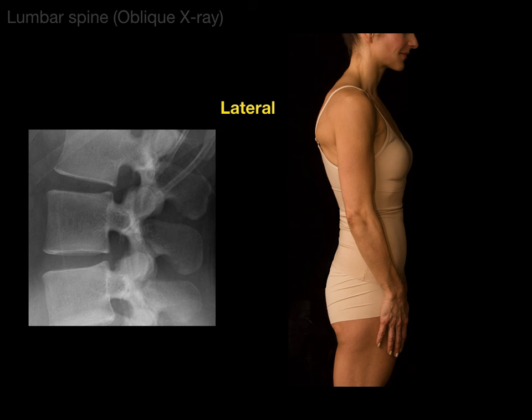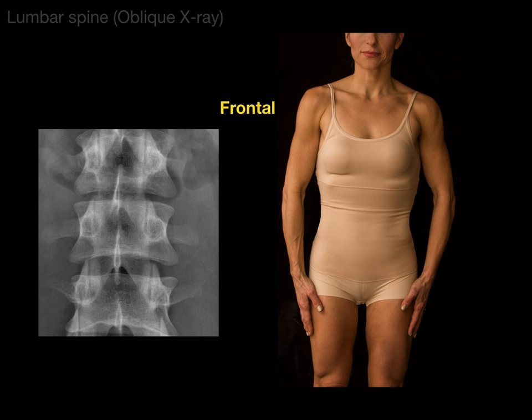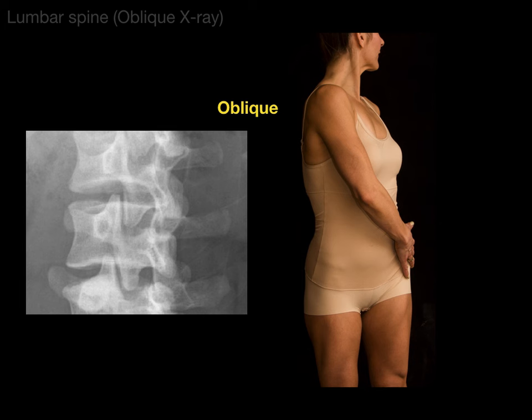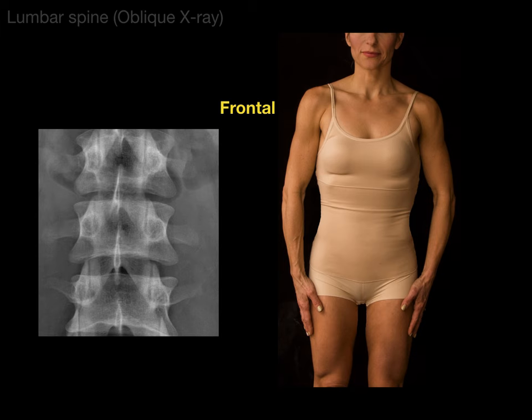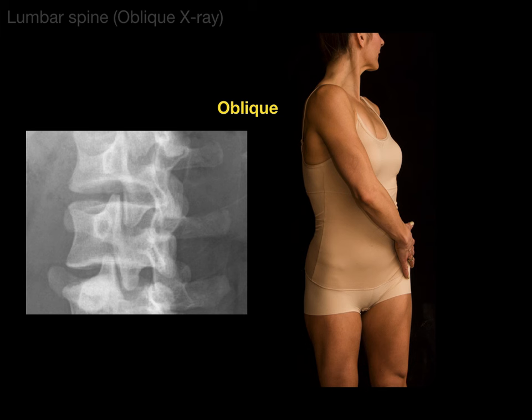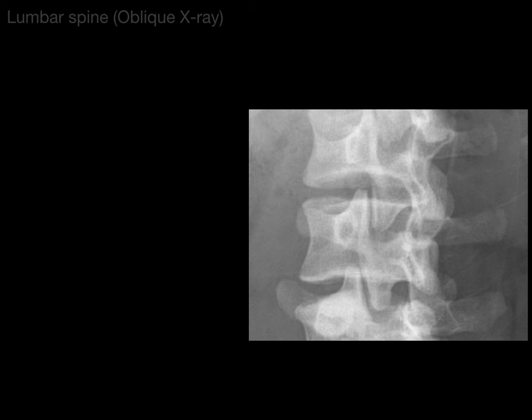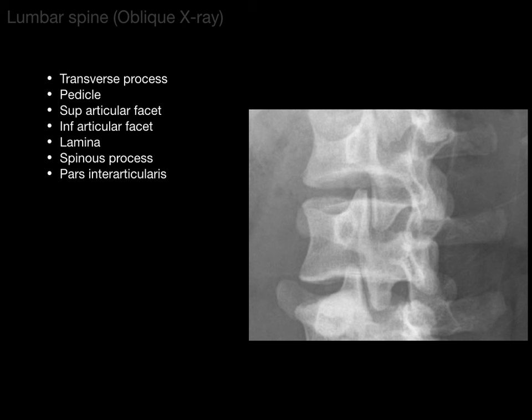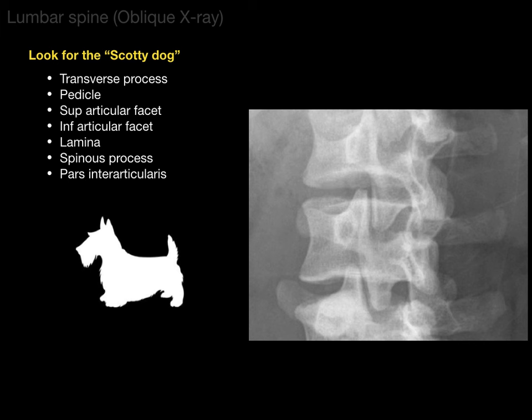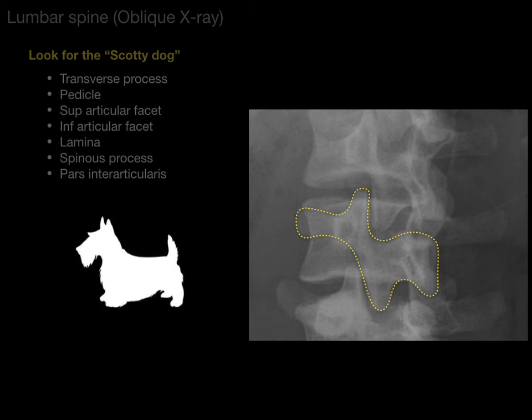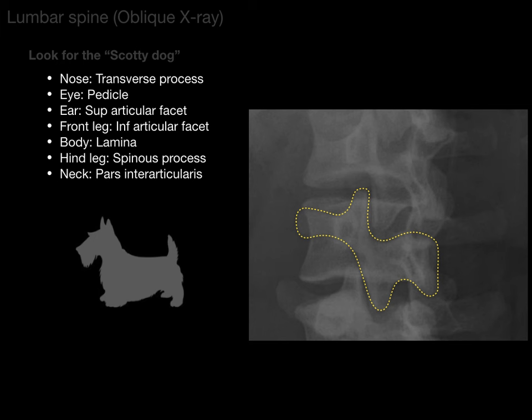The oblique view was hard for me when I first started learning imaging. There's a lateral view, there's a frontal view, and there's an oblique view. Watch a vertebral body go from frontal to oblique — try to find a transverse process, follow it, and see if you can find a spine. This becomes important in understanding the oblique view — how things are just off at an angle. There are all the same structures we've covered before. To best see these, let's look for a Scotty dog. What's a Scotty dog? A Scottish terrier.